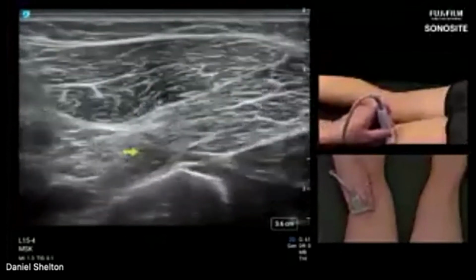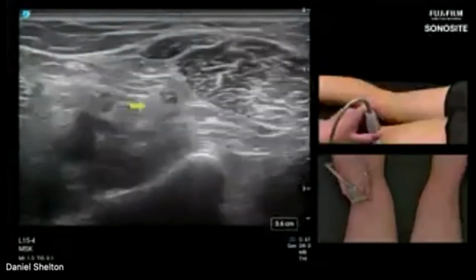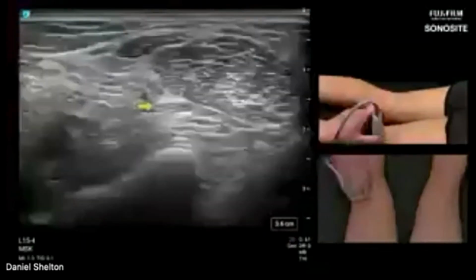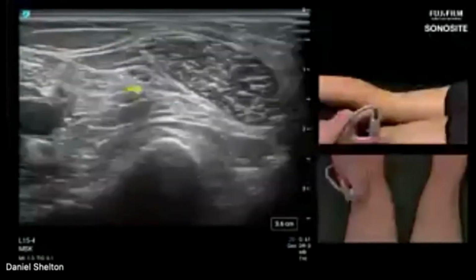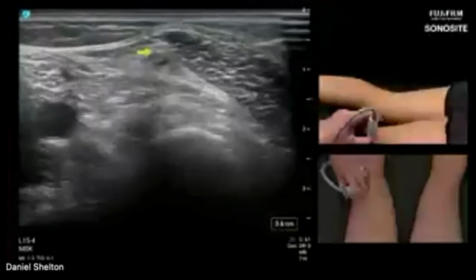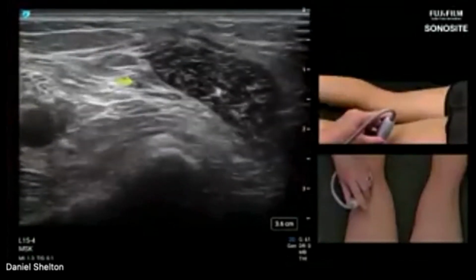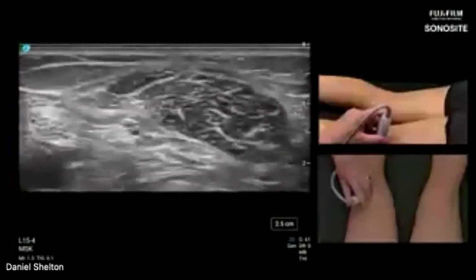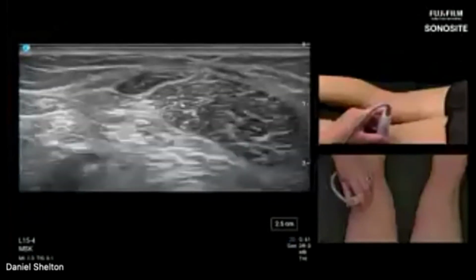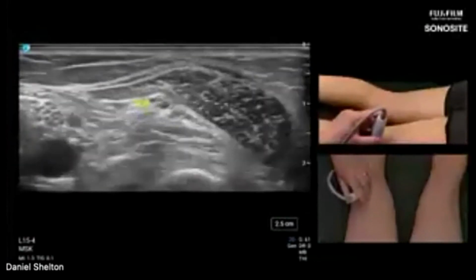And let's chase the peroneal nerve, or the common fibular nerve, depending on when you went to medical school. Here's the fibular nerve in question, or common peroneal nerve, and we're going to chase that up. Since it's going superficially, I'm going to bring my depth up more shallow and let the PX send all of its focus and all the other parameters that we're changing for you in the background to a more shallow target.